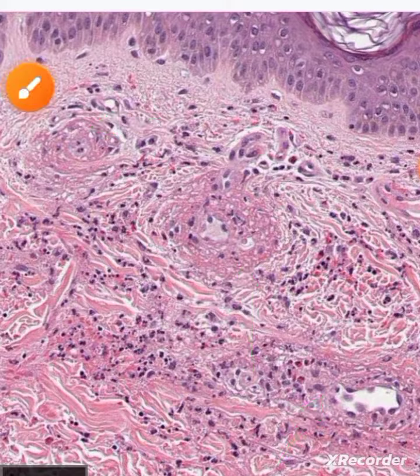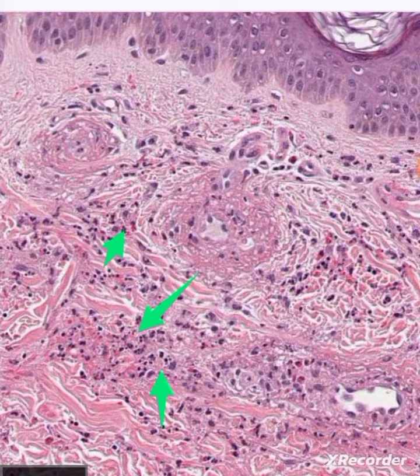Surrounding this material are some neutrophils which we can see here, and there are some eosinophils as well. There is also some nuclear dust — these small remnants are the nuclear dust or karyorrhexis — and we can also see some extravasated RBCs here.